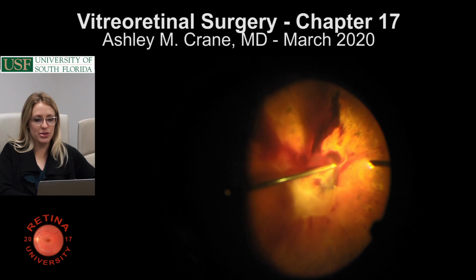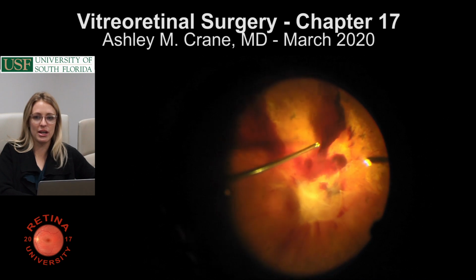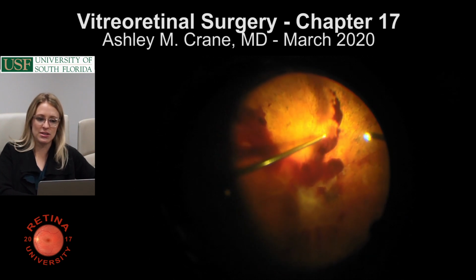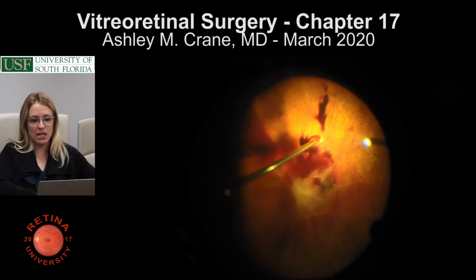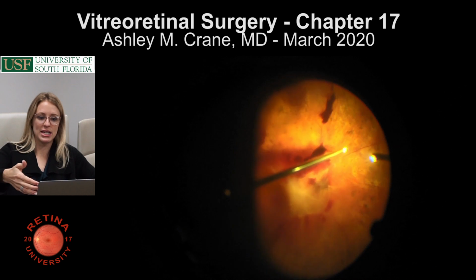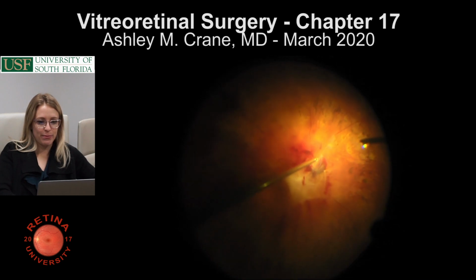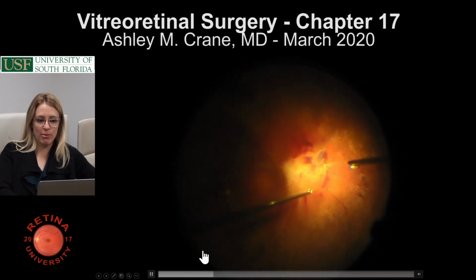And I think with vitreoretinal surgery, when you watch some videos or see it yourself, you'll really understand what the posterior hyaloid is. It's hard to understand until you actually see it being removed, then you get how it's inserted. So basically, the surgeon is going 360 around the detachment and trying to get a plane in between the posterior hyaloid and the retina, and then you're basically picking off this membrane from the surface.